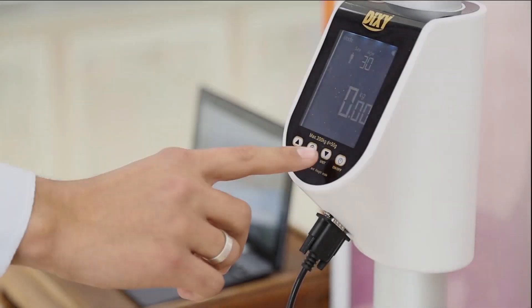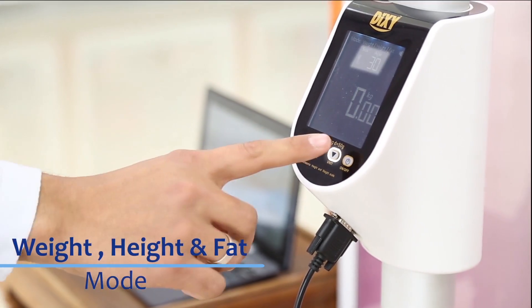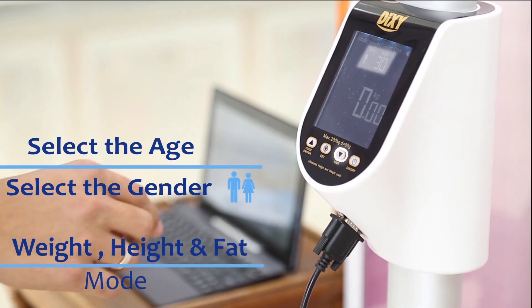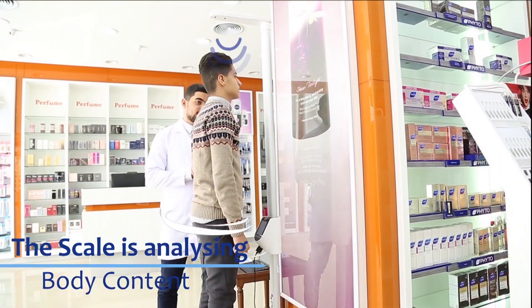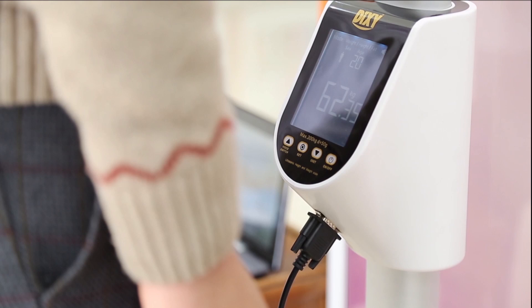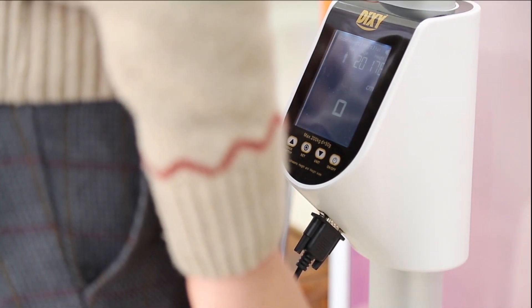Let's try another mode. Change the mode to Weight, Height and Fat mode. Enter the gender and age, then follow the instructions from the scale. Now the scale is analyzing your body content. After finishing the measurement, results will be displayed on the screen and the scale will speak out the results.